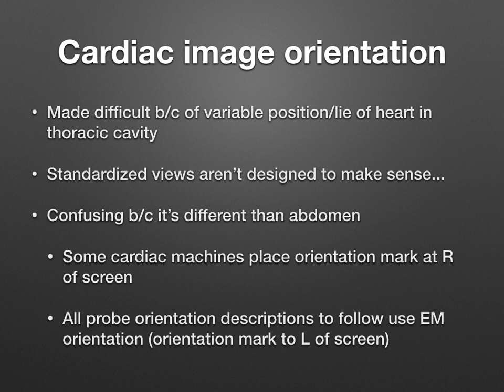And to make things even more complicated, on a lot of the echo machines or the cardiac machines, you'll see that the orientation marker is on the right side of the screen. But in emergency medicine, we always keep the probe marker to the left side of the screen because we scan both above and below the diaphragm. For this reason, you might notice that your pictures look a little bit different than the cardiologist's pictures.